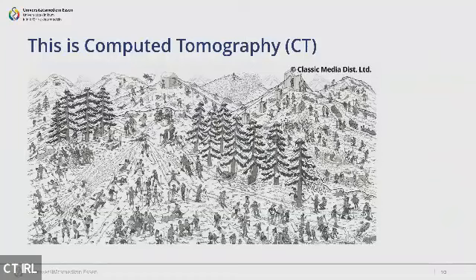How does this work in terms of the imaging properties that we can get from our PET-CT hybrid imaging? You might know these images. Everyone with kids and children's books might have seen one of these in Germany. They're called Wimmelbücher. And I think these are from a famous British author. It's all about seeking Waldo or Wally. Where is Wally? This is what CT can do, right? You get a detailed image of your body. You get all details. You can see enormous amounts of different figures and persons in this image. But the question is, where's Waldo?